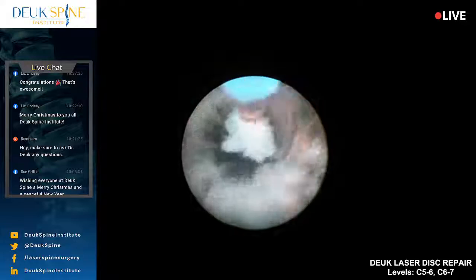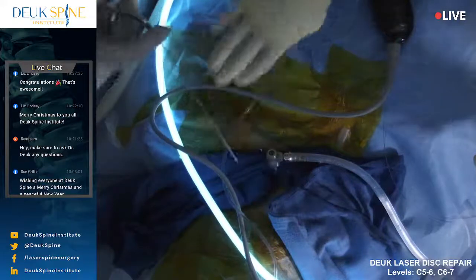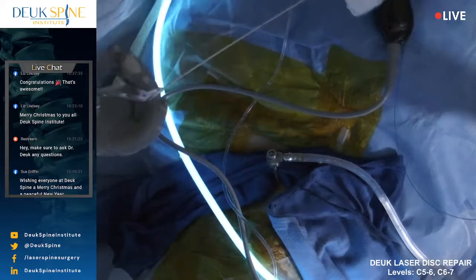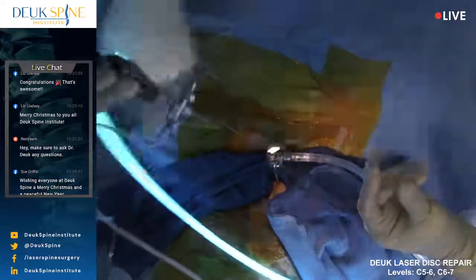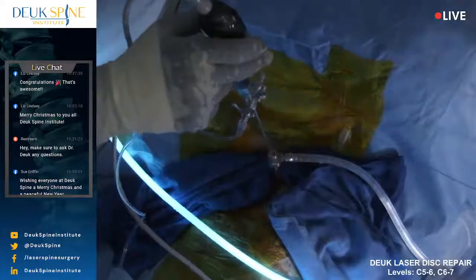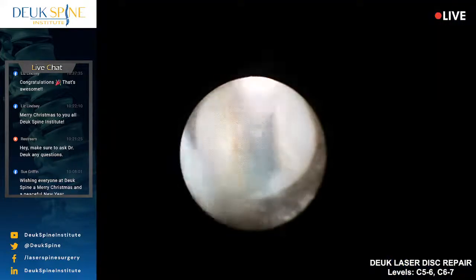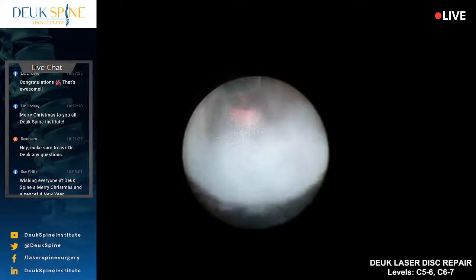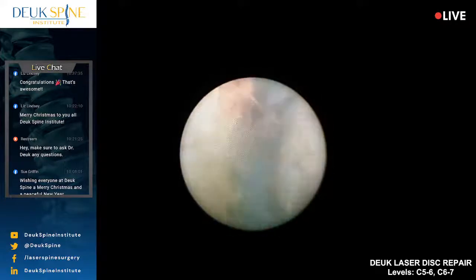So to get that guy out, I put a little pressure down on the tube to push the bones apart and open that gap at the back of the disc and get better exposure to the epidural space. There it is. All these pieces, by the way, they're only maybe 2 to 3 millimeters. They're not huge because remember the tube is only about 4 millimeters on the outside, but the inner diameter is around 3.2 millimeters. So a herniation that fills the tube is only around 3.5 millimeters wide anyway. So it looks big, but it's not that big.